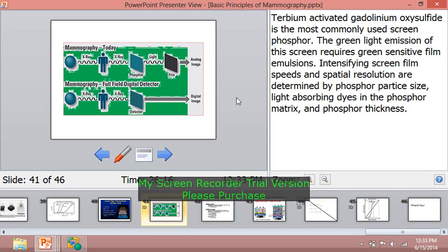But in full field digital detectors, the breast tissue after exposure, the X-ray information is directly located in the detectors, and in the detectors the X-ray information is directly converted into the electrical signal, and we only need here the analog to digital converter to form the image, which is actually done in the computers.